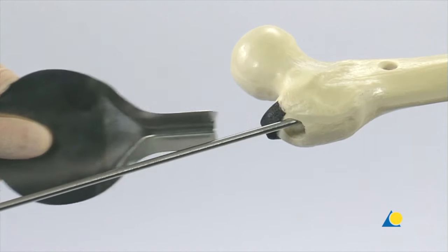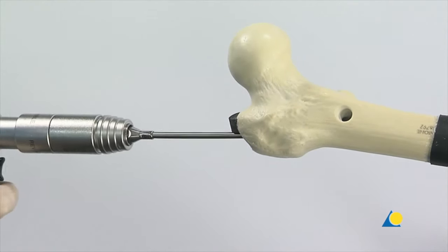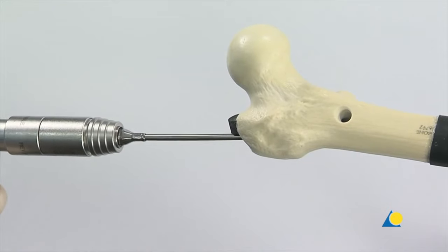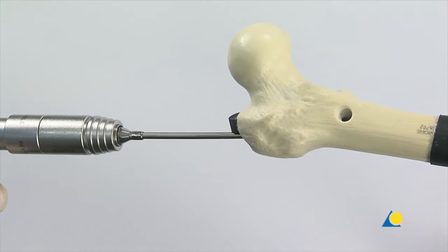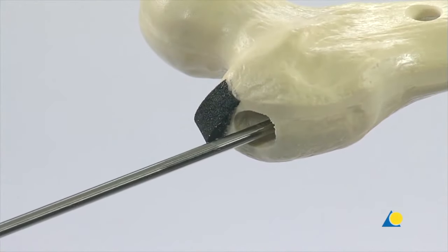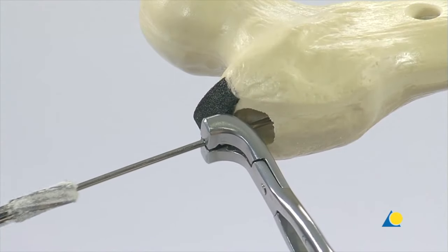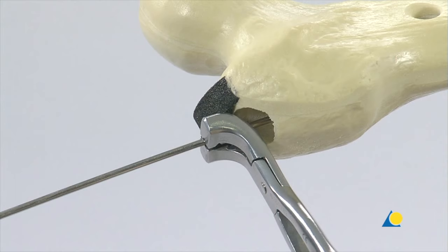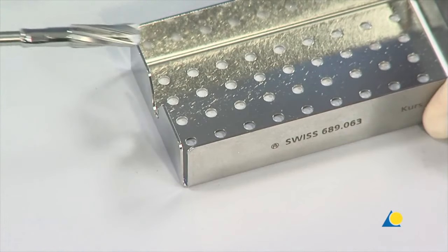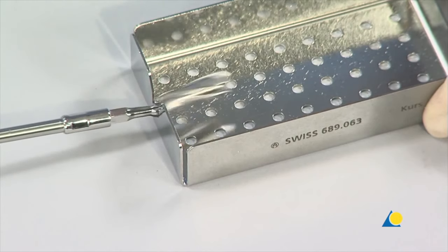The reamer is used at the highest drive speed with slight and steady pressure, moving the drive back and forth. This movement frees the reamer from bone material and prevents the reamer head from jamming against the reaming rod. After the entire length of the medullary canal has been reamed, the reamer is withdrawn without bending the rod until the reamer head is completely visible. The reaming rod must be held in position by the assistant with the holding forceps to prevent it from being pulled out with the reamer. To remove the reamer head, it is inserted into the slot of the removal box for reamers and the flexible shaft is pulled back.